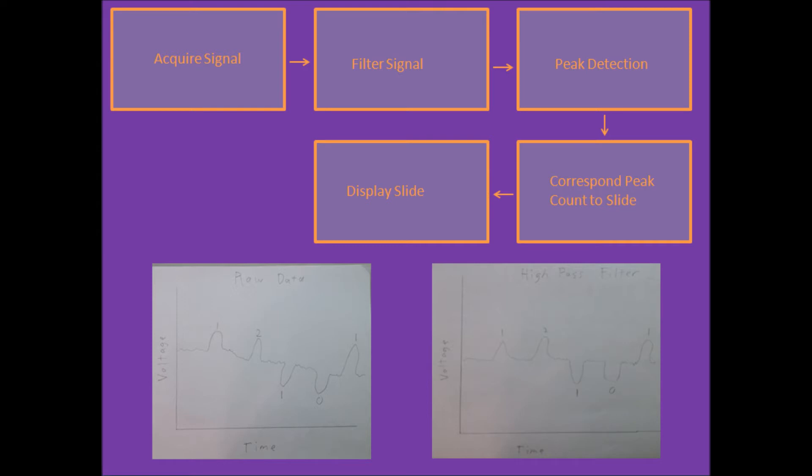Next, we need to detect the peaks of the signal. When the user looks to the right, there will be a positive peak relative to the baseline. When the user looks to the left, you will see a negative peak relative to the baseline. LabVIEW has peak detector VIs that will detect these peaks and send the peak information to a MATLAB block.